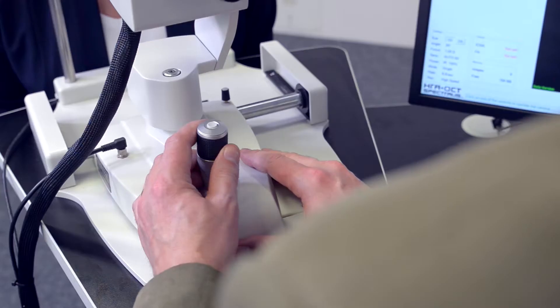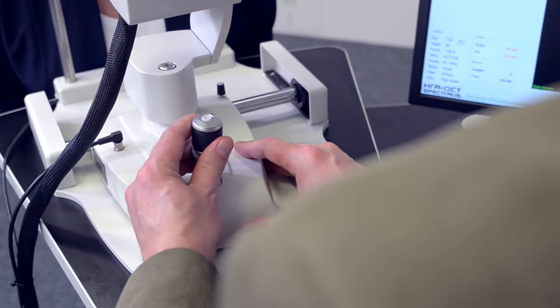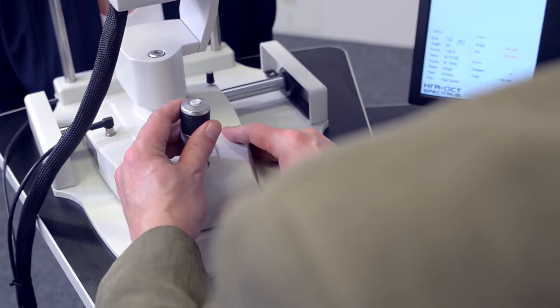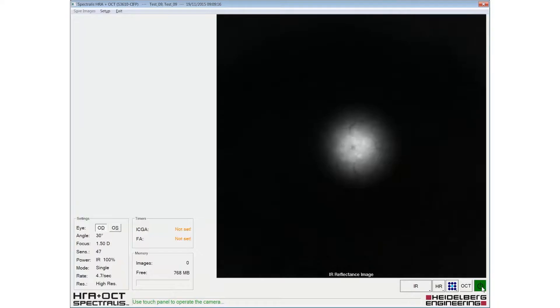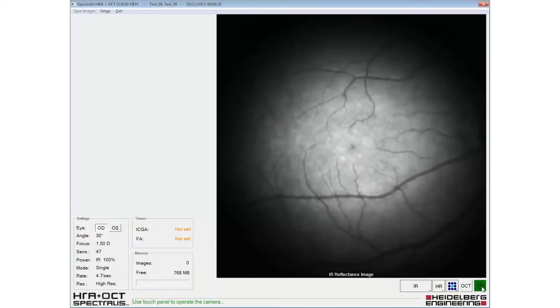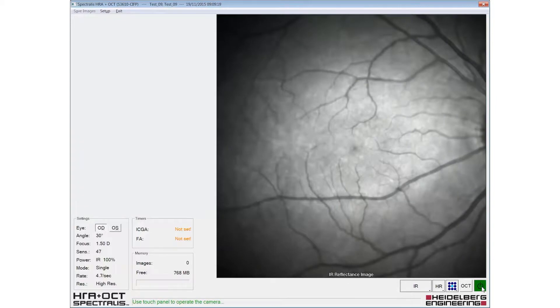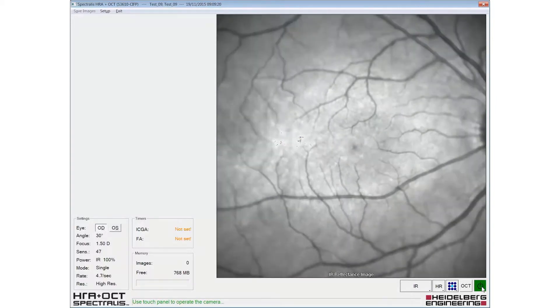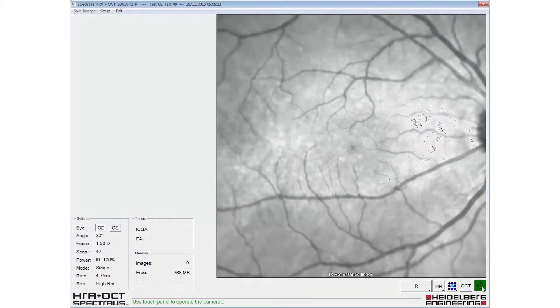The fundus image is aligned by sliding the camera head forward, keeping the reflex from the patient's pupil central. The fundus image should be evenly illuminated from edge to edge.